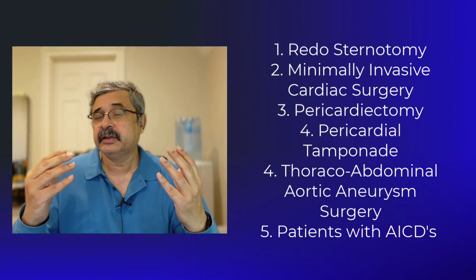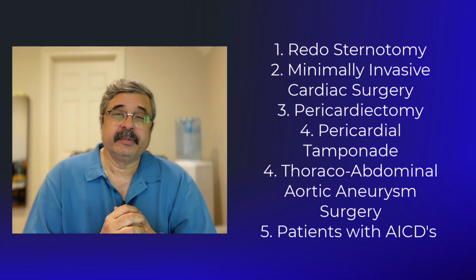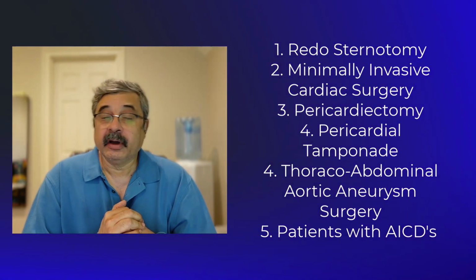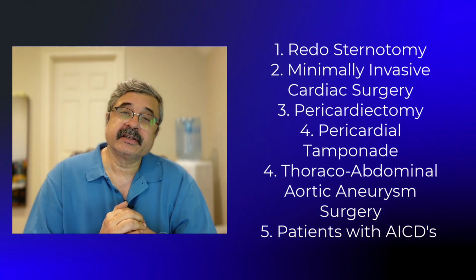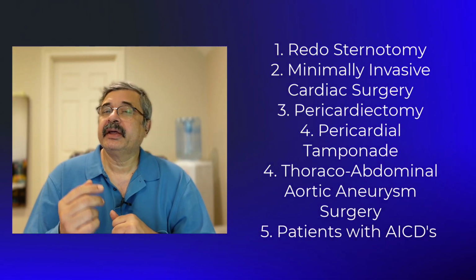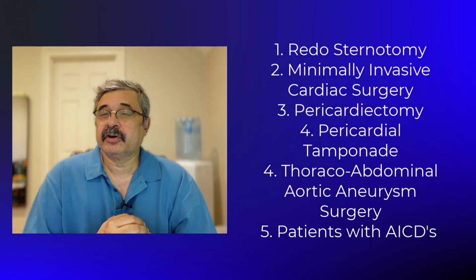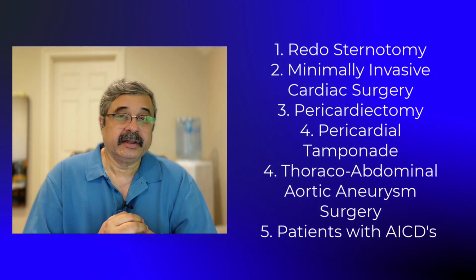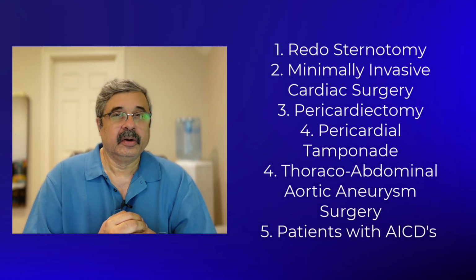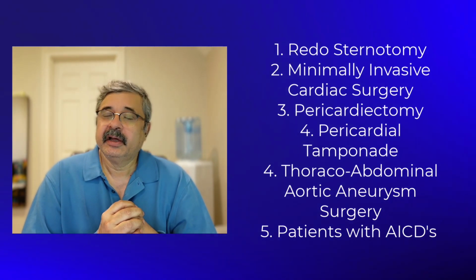So for as long as the heart is not fully exposed, the R2 pads, once applied, are the ones that should be connected to the LifePak 20E. And when the heart is completely exposed, and the cardiac surgical team confirms that internal cardioversion paddles can now be applied, the external pads should be discontinued, and the internal cardioversion paddle cable that is dropped from the field should be taken and connected to the LifePak, just in case the patient requires emergency cardioversion or defibrillation. So this is, again, a very important communication that happens between the cardiac anesthesia and the cardiac surgical team.